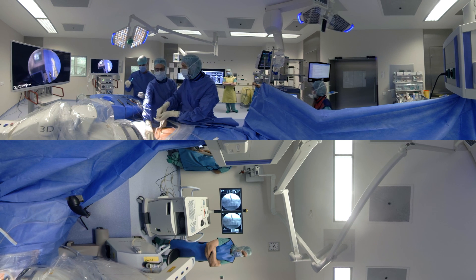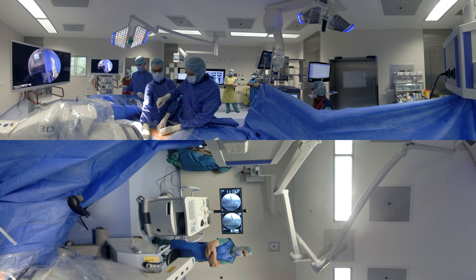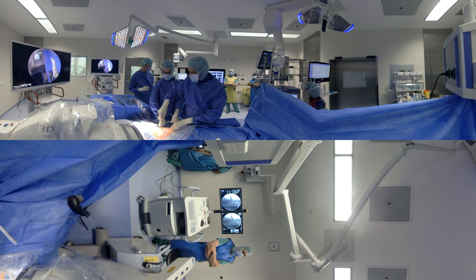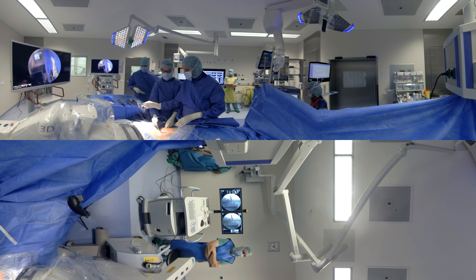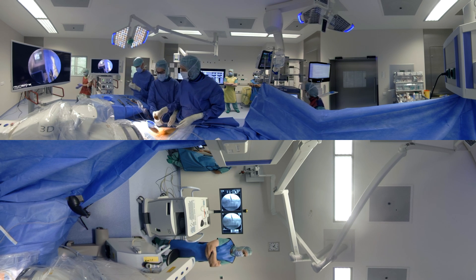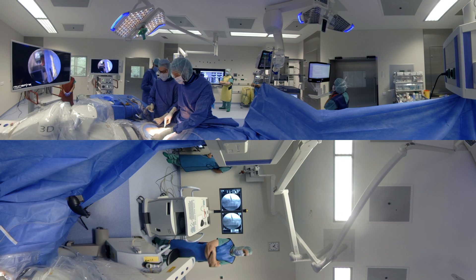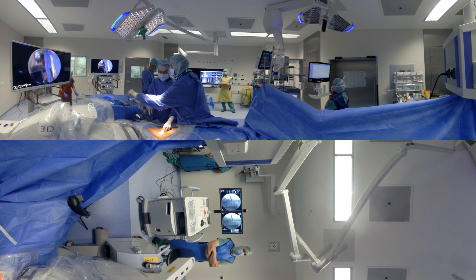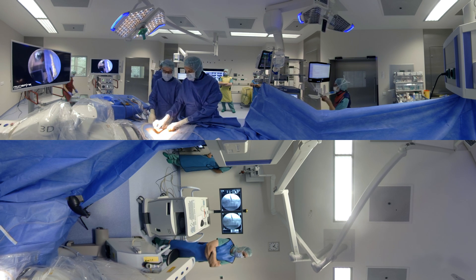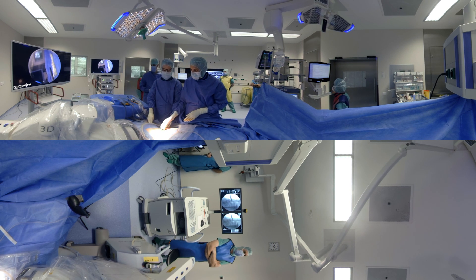We add just a little bit of perineural infiltration — a little bit of cortisone around the nerve root. You simply remove this one instrument. Same thing whether it's a 50 kilo or 150 kilo patient — you do a single stitch and that finishes the surgery. You can see a single stitch, and then you've done a full discectomy sequestrectomy through a small six to seven millimeter incision.